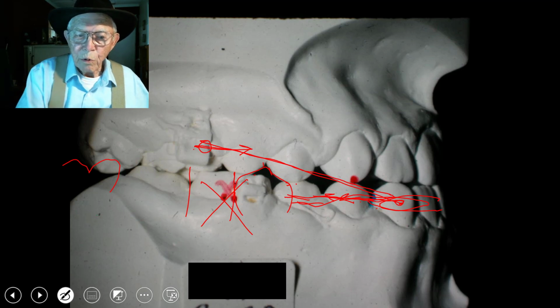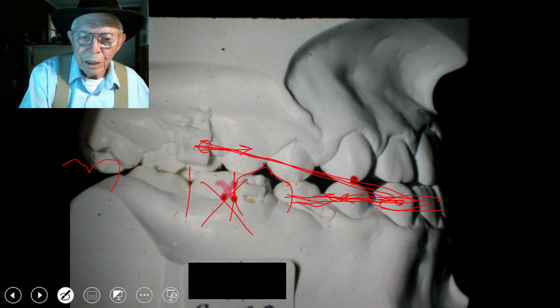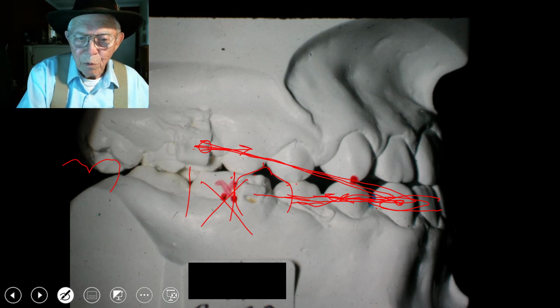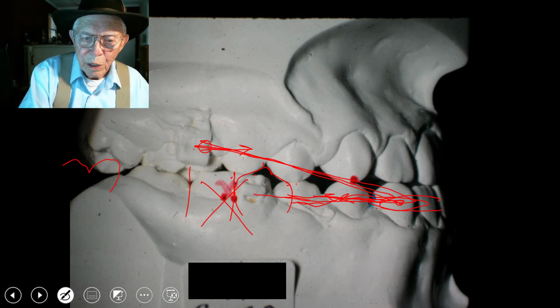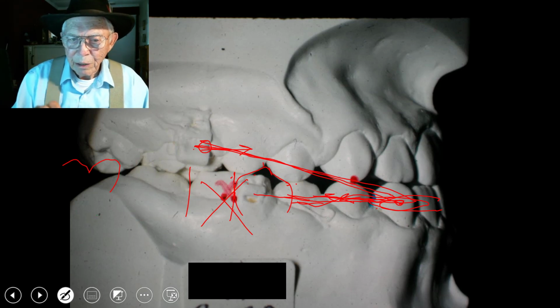Alright, so we're going to be pulling with Class 3 elastics, and we'll be pulling these lower teeth back in this direction right here. And as we get further and further back down here, we have to watch so that we come in here with correcting this.